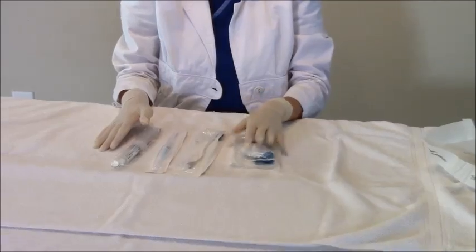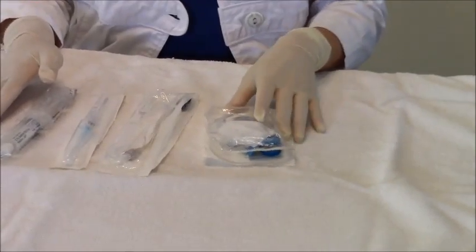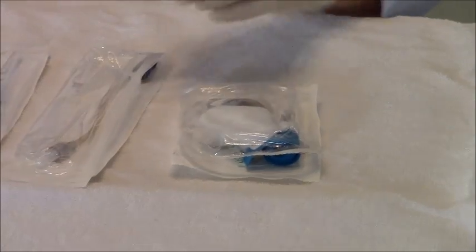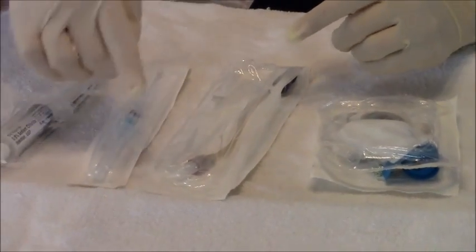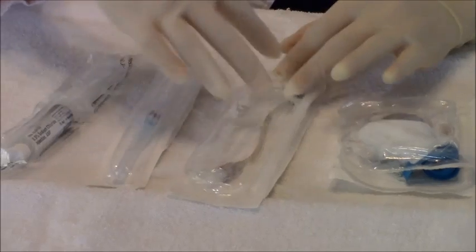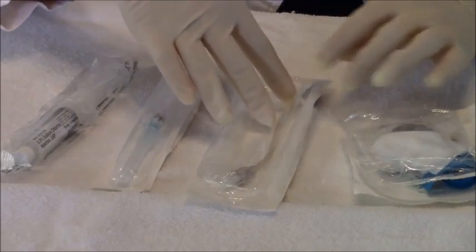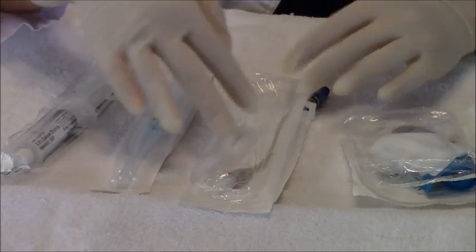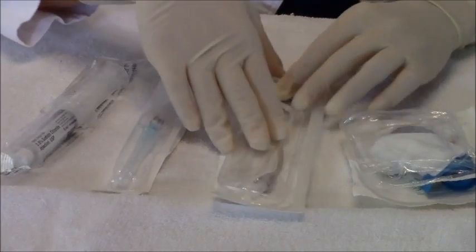First, we have our IV Start Kit. These are in most clean holds. It has everything that you will need to start your IV. You will need an extension to connect to the IV. This right here that I have is a long extension. Some facilities just have the cap or they have this, so you can choose either one you need.